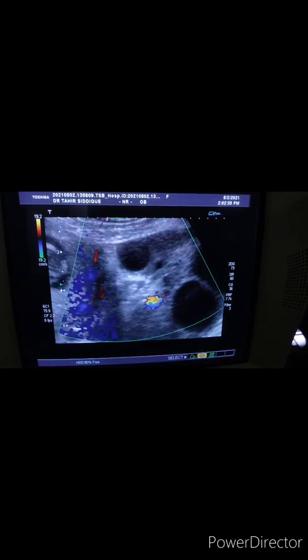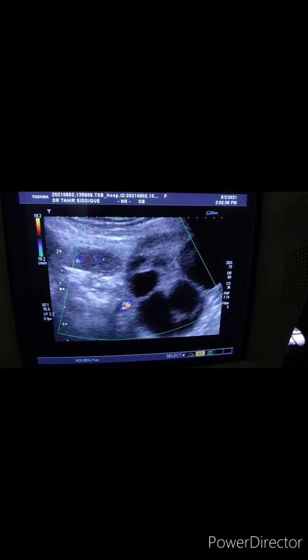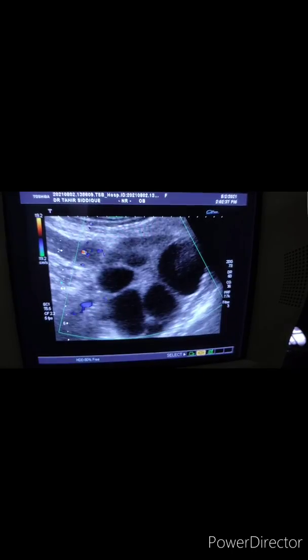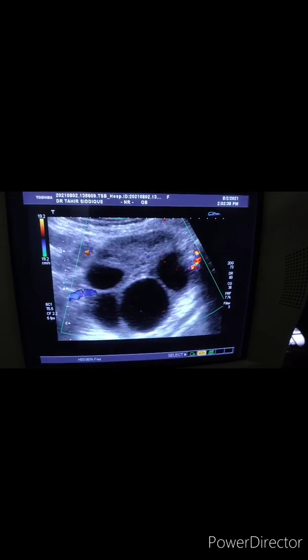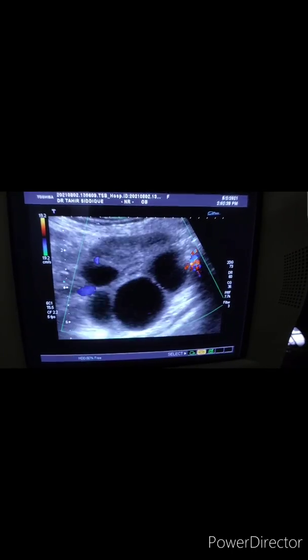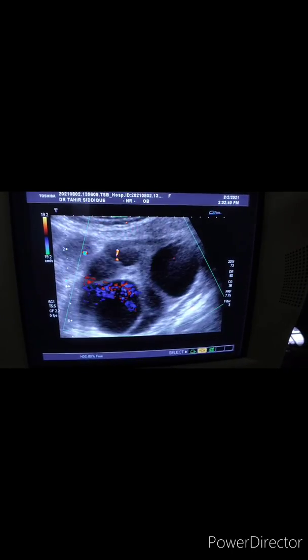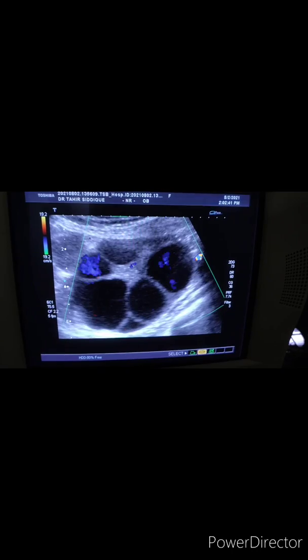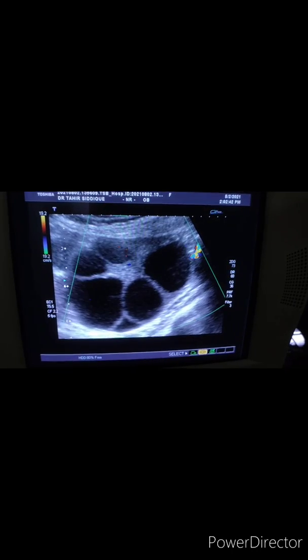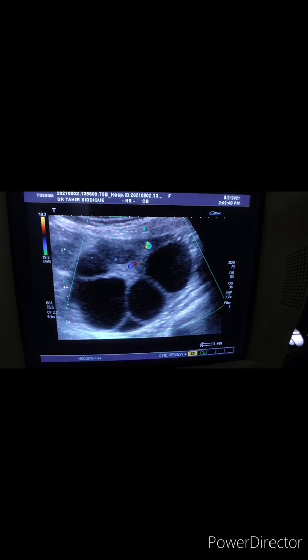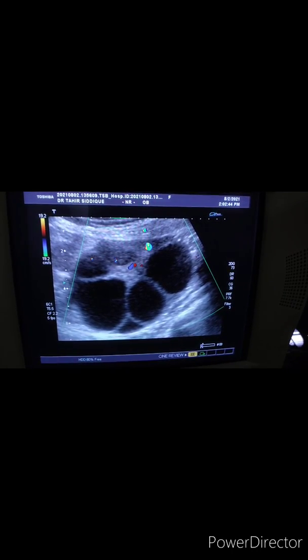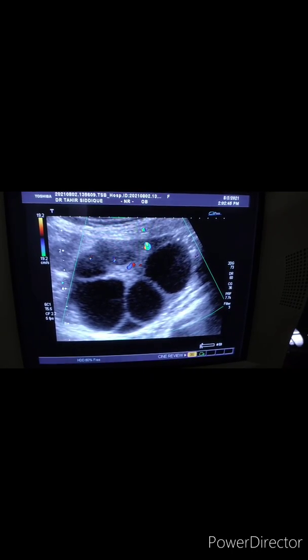This is the left ovary. Case of the day — thank you very much.